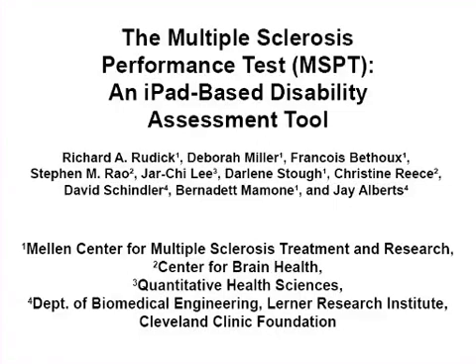The overall goal of this procedure is to assess neurological and neuropsychological performance using an innovative iPad-based application, the Multiple Sclerosis Performance Test, or MSPT.